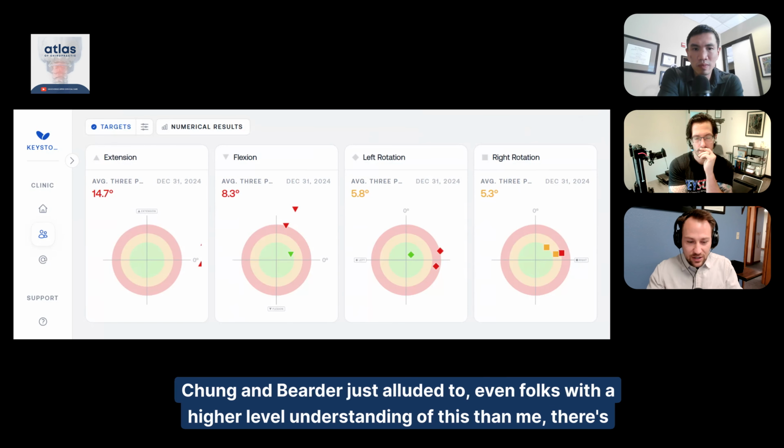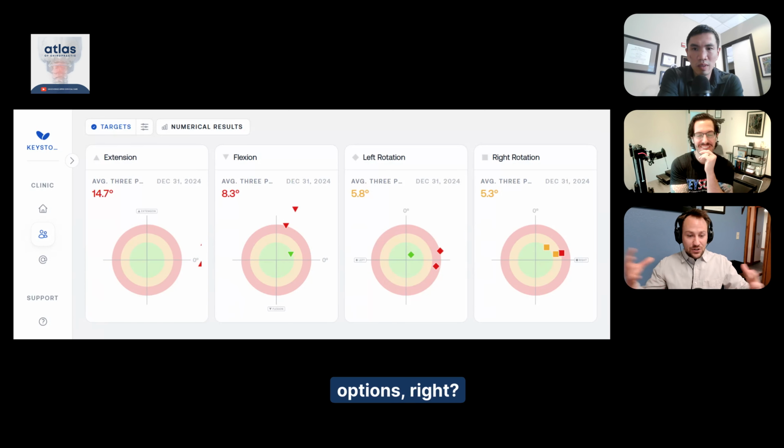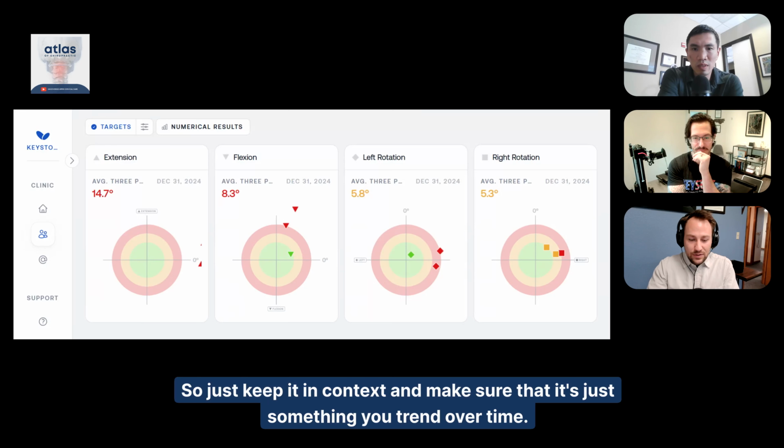Because as Dr. Chung and Bearder just alluded to, even folks with a higher level understanding of this than me, there's options, right? There's a lot going on with this stuff. So just keep it in context and make sure that it's just something you trend over time.